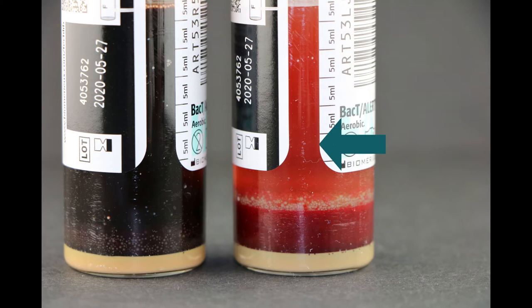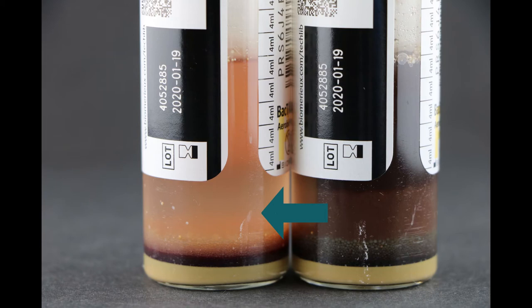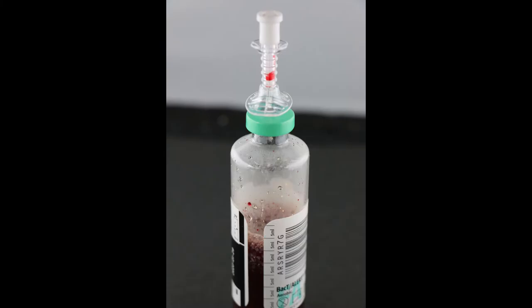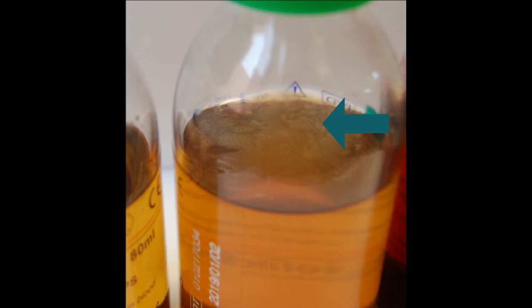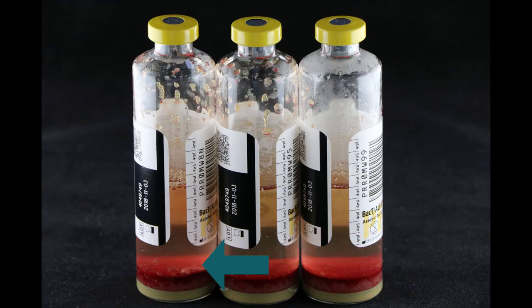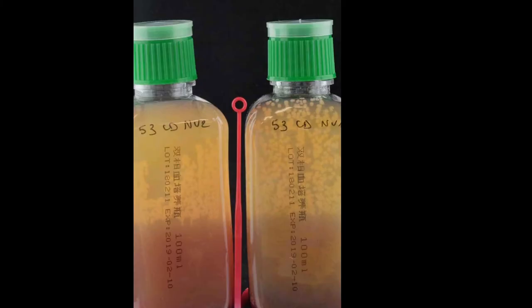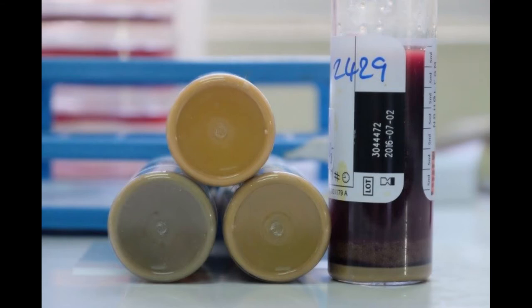Signs of growth are turbidity, hemolysis, color changes in the medium, gas production, pellicle or film formation, visible colonies like puffballs. In case of biphasic bottles, you can also see colony growth on the solid agar.